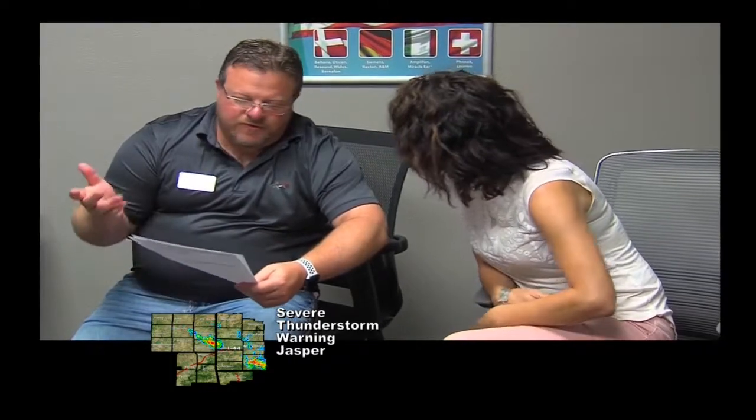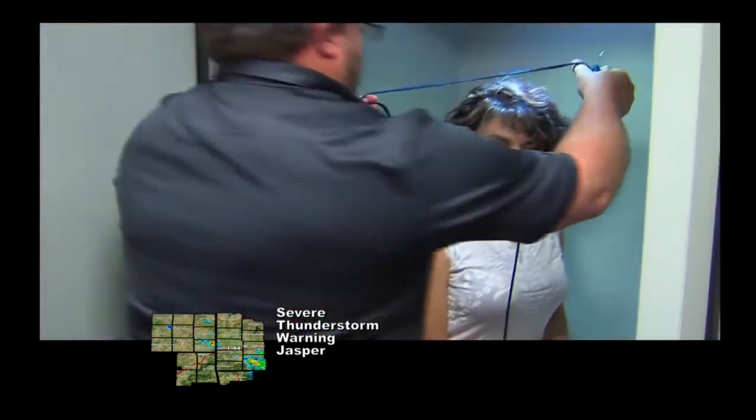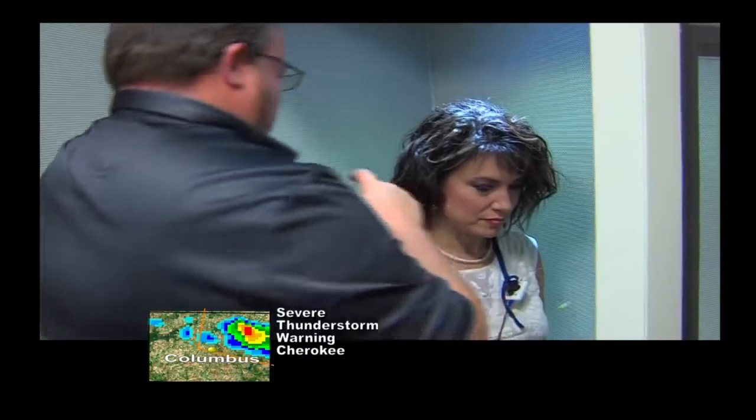And then that gives you a reading and tells you what? We get all your thresholds, different frequencies, find out if there's a hearing loss or not. You're very mild. No hearing aids at this point. Yes. So see, I did have a mild hearing loss.